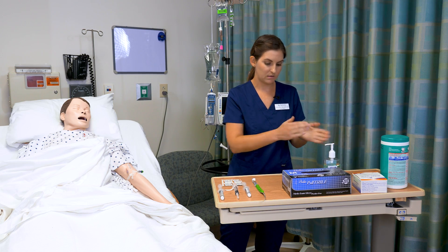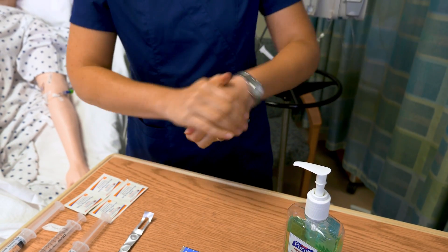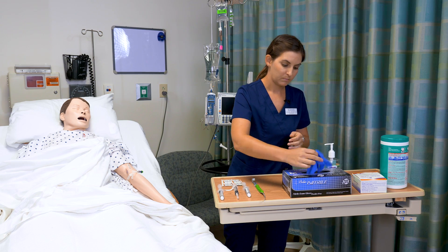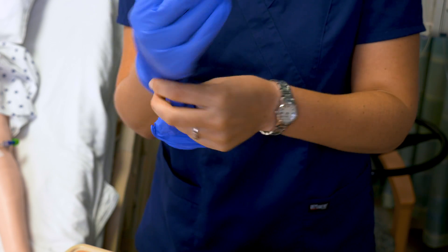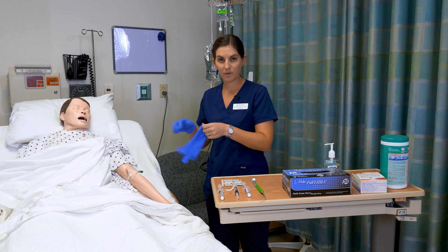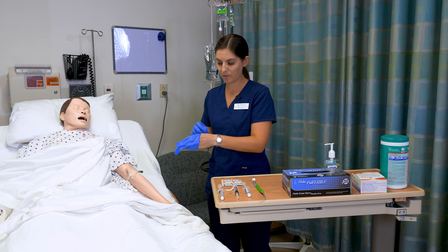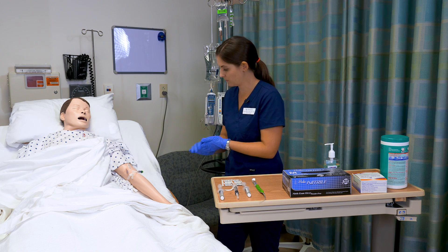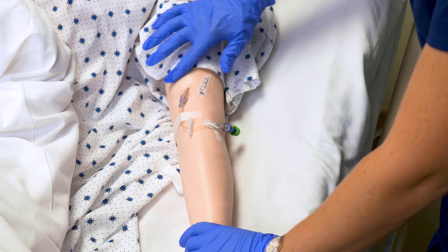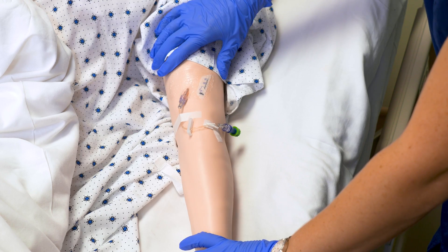I'm going to wash my hands and put on my gloves. I have checked my medication and explained to my patient what I am doing. I'm following all my eight rights of medication administration. I do not see any redness or signs of infiltration.